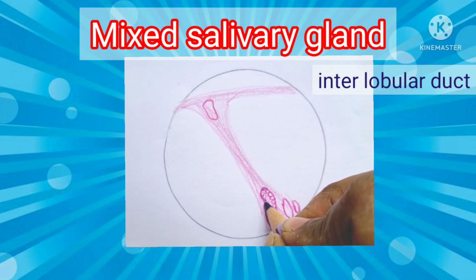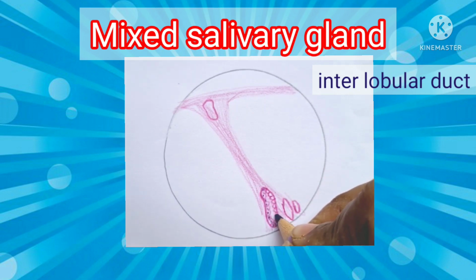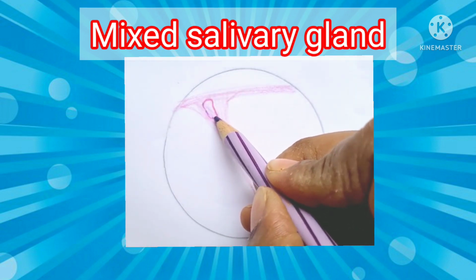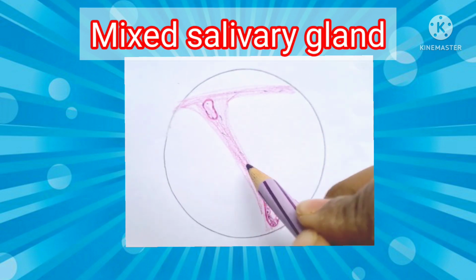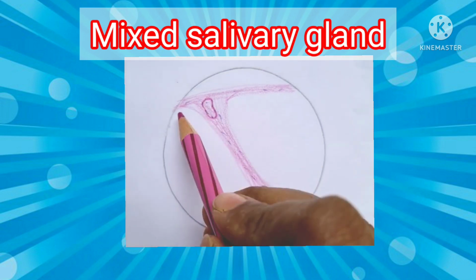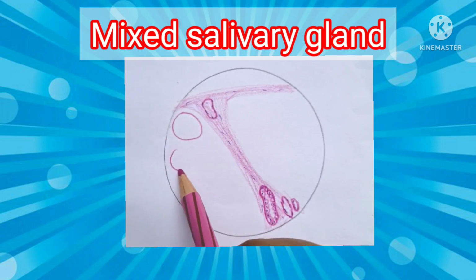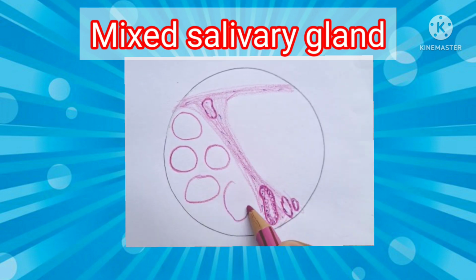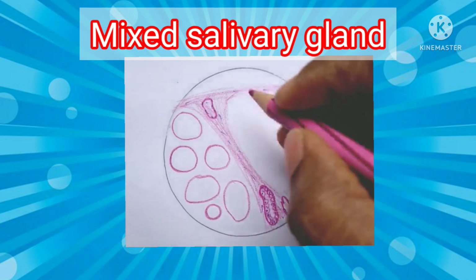As it is a mixed salivary gland, we have to write both serous and mucous acini. But the number of serous acini will be more. You might have confused this slide with a serous salivary gland. You should look carefully and identify the mucous acini and demilunes. The serous demilunes are the key thing in the mixed salivary gland.